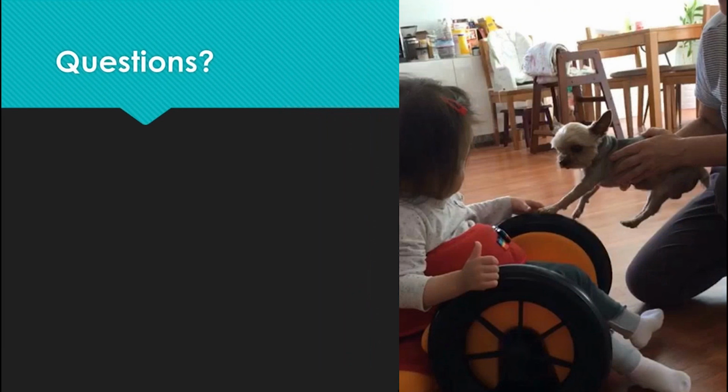We've one other question here from Maggie. Is there any chance of producing a version that is easier to switch between the configurations, as it currently requires tools and therefore does not happen? Yeah, Maggie, that's something that we're all aware of. We know how user friendly that transition between the configurations is, and we know it could be more user friendly. Hopefully in the future it's something that we can look at. At the minute, when we're changing between configurations, we've got very quick at it just because we're doing it so often. So it's like anything in that respect, but hopefully we will be able to improve on that.